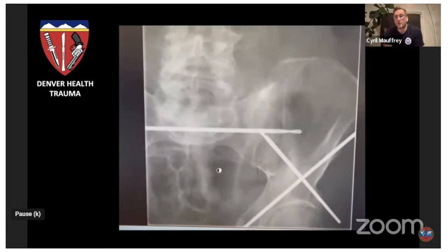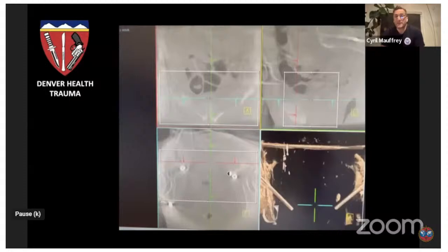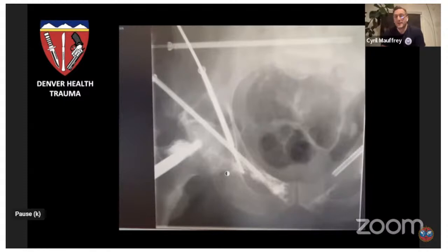And all the wires are placed. We're measuring all the wires. We're putting all the screws up to, this is the probe. You can see the thermal probe. Now we're aiming for the tumor cells and injecting the cement right there in all the various lesions.